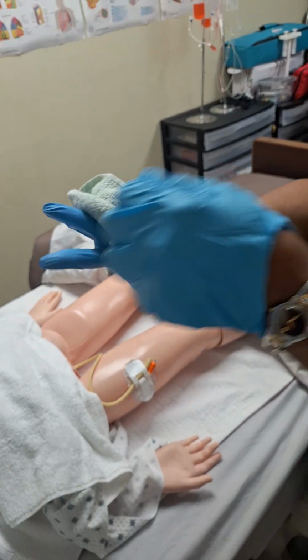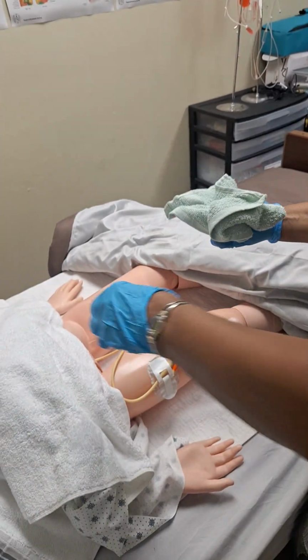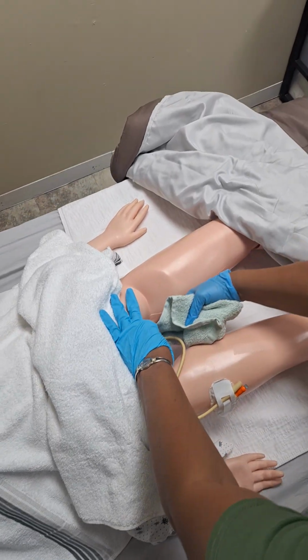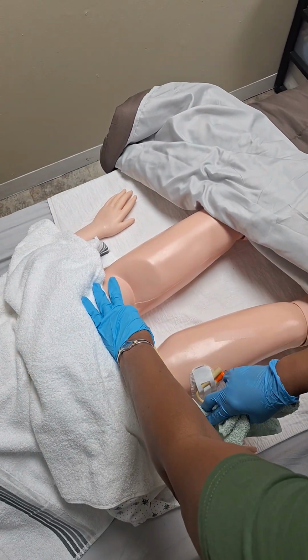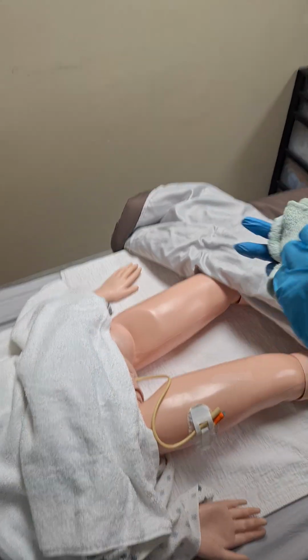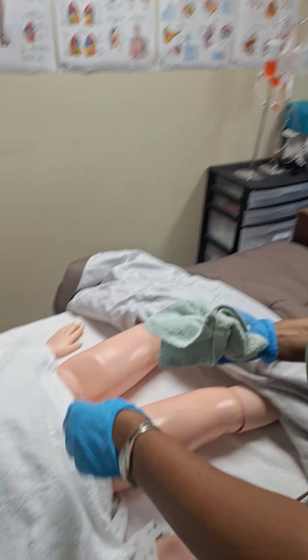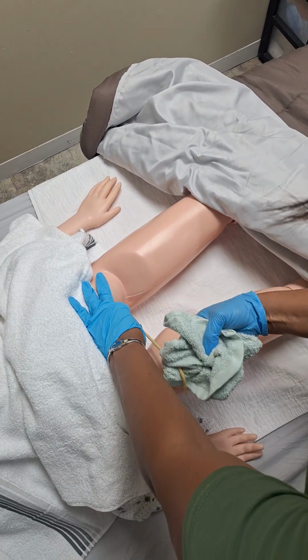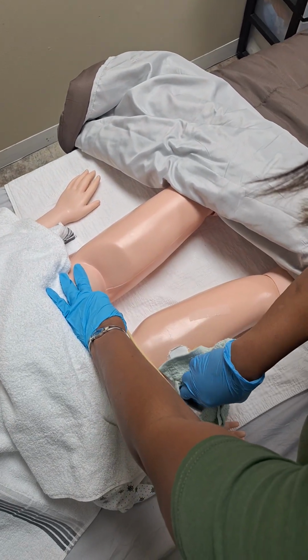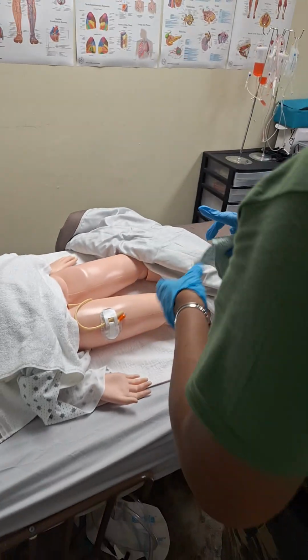I'm going to pull my towel back. I'm going to grab my 2 fingers out and hold it again. Hold it at the meatus. And I'm going to wipe down 3 to 4 inches, letting my proctor know. I'm going to take another set of my towel. I'm going to hold it again. So I'm holding the whole line, and I'm wiping 3 to 4 inches down again without pulling. Whatever you wash, you must rinse.